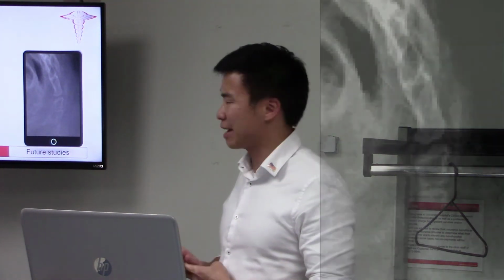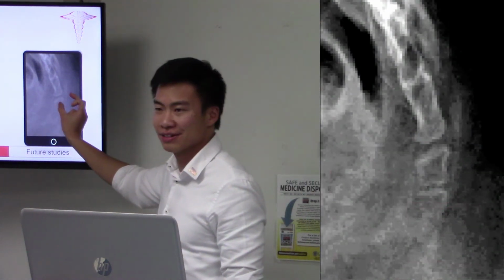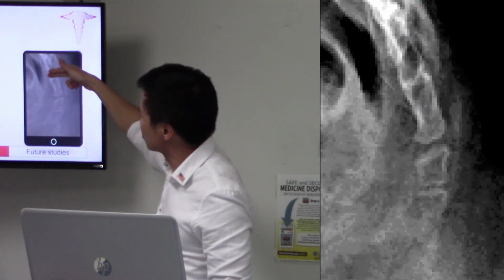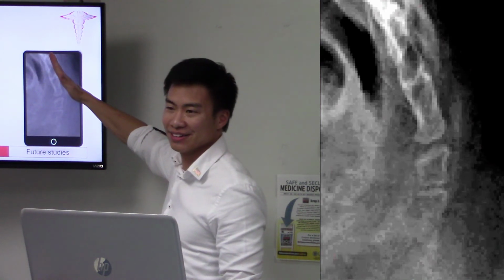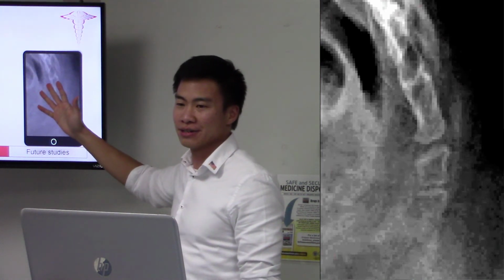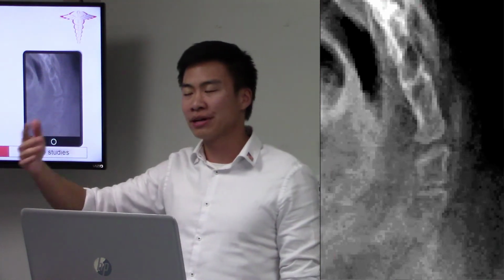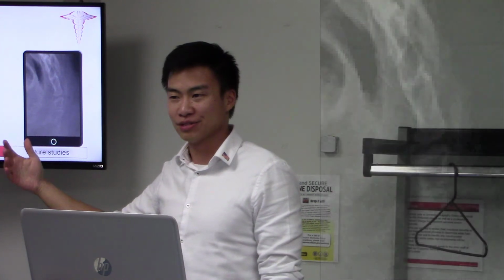So I've talked about that. So what are these signs? Dr. Main has 3 signs. He looks at the obliquity of the joint, so see how it's oblique. And he looks at this distal part, and whether it's straight or even extended, and those are his signs. Using just these 3, the preliminary data show that he was able to predict 70% of hypermobile joints just on standing X-ray.